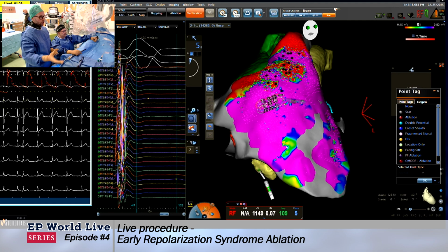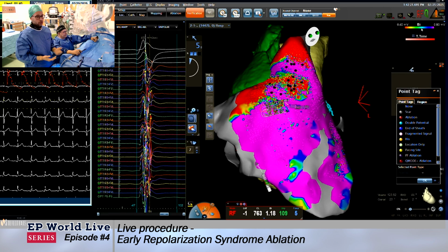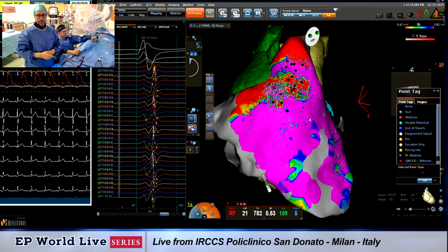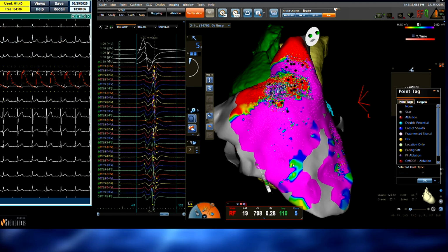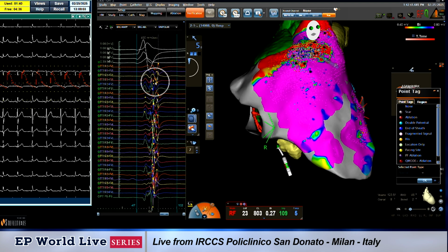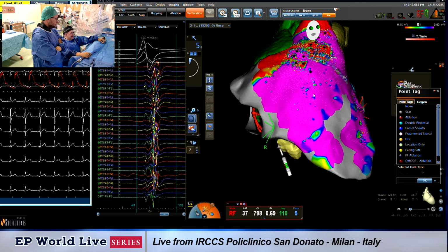Professor Pappone has shown that some cases with a severe pattern of early repolarization pattern and cardiac arrest have involvement of the peritricuspid area, but also you can see that you have late activity. If you look in the CARTO, you have a near field close to the ventricle and then a late activity. These double potentials are not normal. And again, if you compare with... Beniamino, can I see here the gross anatomy of the pericardial fat we detected at the CT?